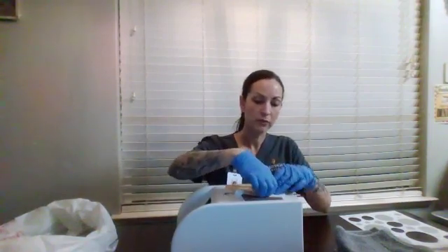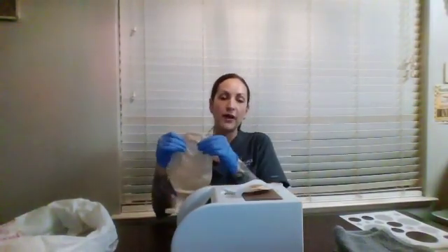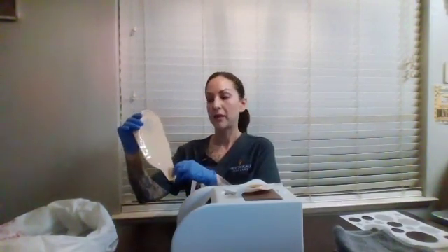First, you're going to remove the pouch by gently pulling towards you. If the provider indicated, we would measure the liquid inside of the bag before discarding the liquid in the toilet. If needed, the clamp at the end could be clamped and then you can discard this in the trash. For this purpose, I'm going to be setting this to the left of me and using this as my new colostomy bag.